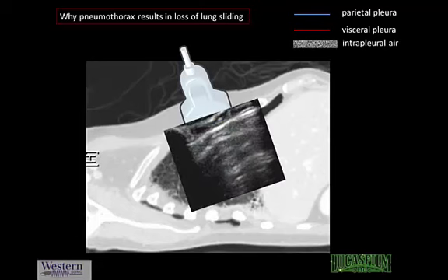So you can imagine that in this case, you see a quiet, very still, non-dynamic pleural line framed again by the rib shadows, which are seen here, and there's absolutely no movement. There's a little bit of movement of the operator with the probe and efforts and breathing from the chest wall, but the line itself is static.